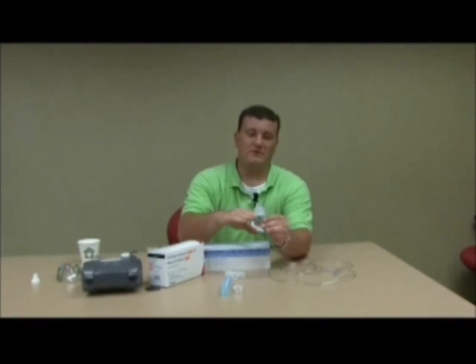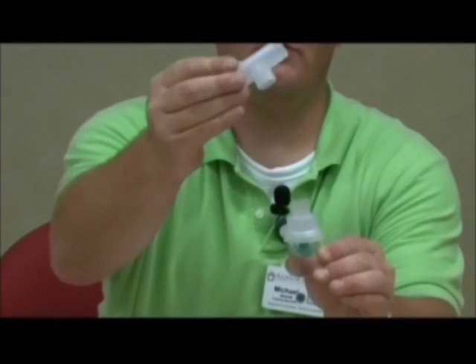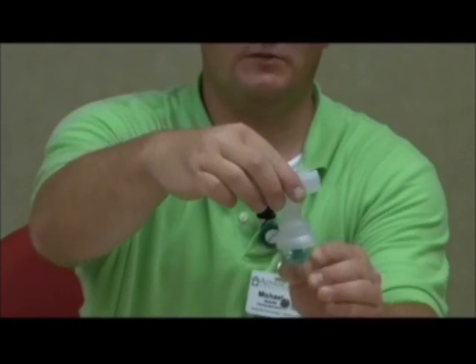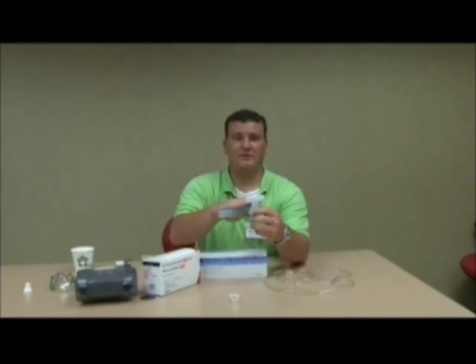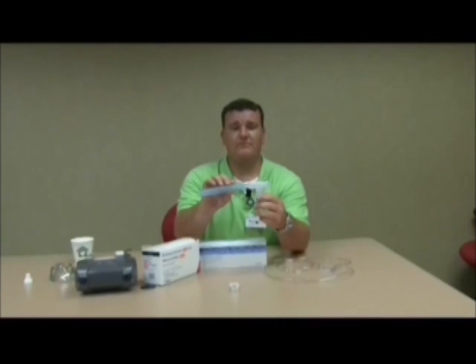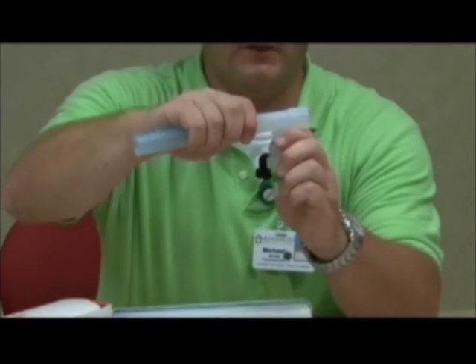Next step, once you have your medication in the medication cup and your lid is on, the next piece that will need to come into play is your tea piece, which looks just like this. It only works one way — it would be snug this way. Simply push down on it until it's snug. Once you have your tea piece on correctly, you will then grab your corrugated tubing. This tubing will attach to only one end as well. Simply place it on the front, just like that.